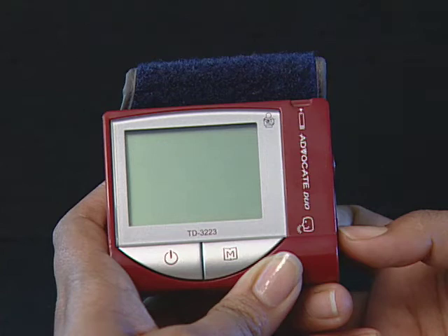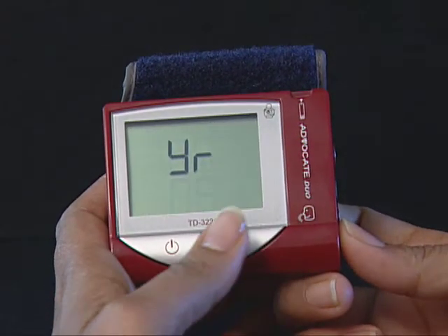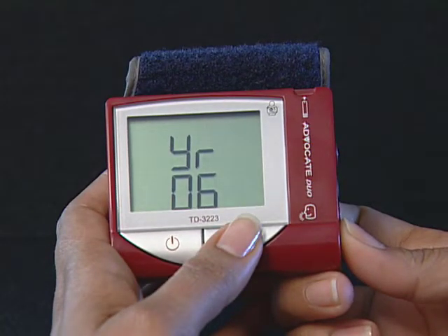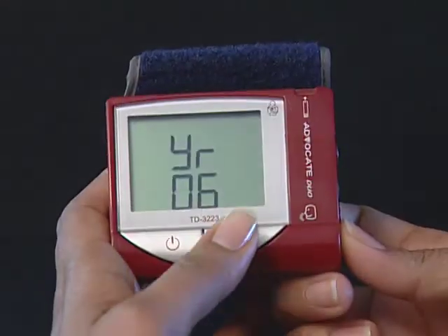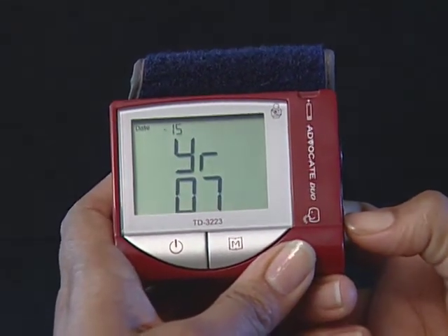Step 1: Start with the meter off, then press the set button. The meter is now in the setting mode. Step 2: Set the year. The year will appear first with the year setting flashing. Press and release the M button to advance one year. To move faster, keep pressing the M button until the desired number appears. With the correct year on the display, press the set button and then the month segment flashes.